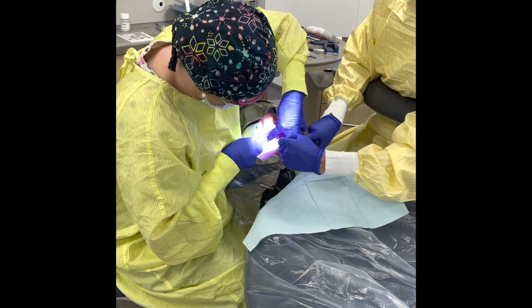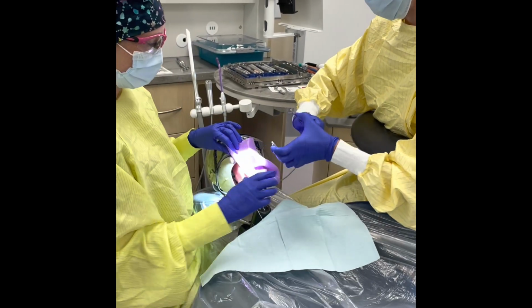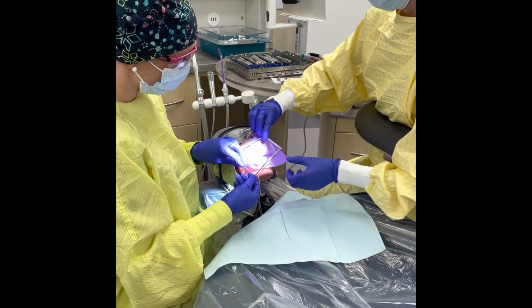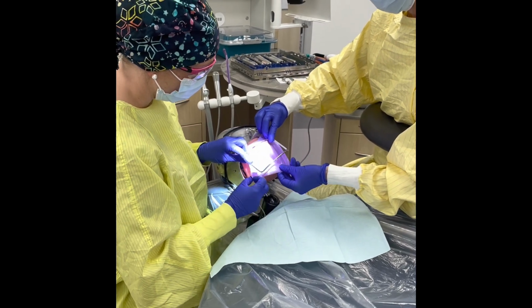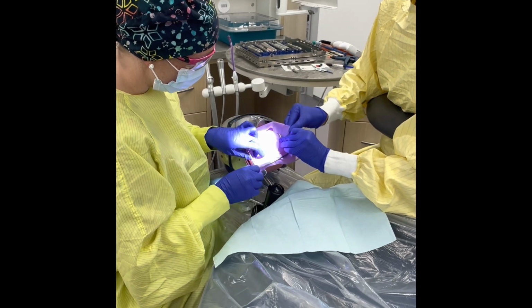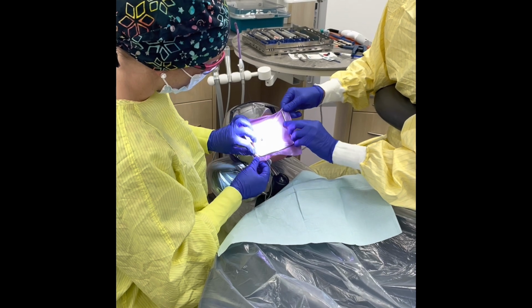All right, so I'm just going to slide it around the clamp here. And then we can kind of do this together. Yeah, it's a four-handed dam placement is what we're working on here. Amanda will do that side, I'll do the left side. Making sure that our safety floss is around our frame.